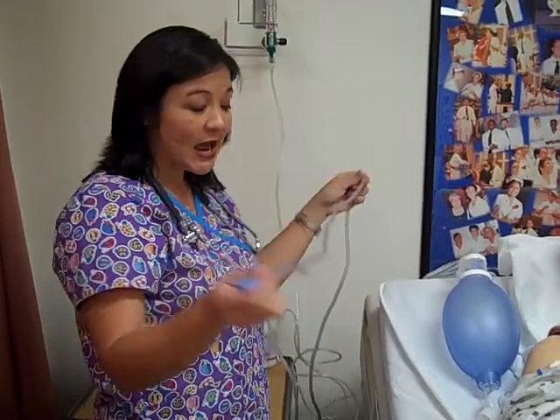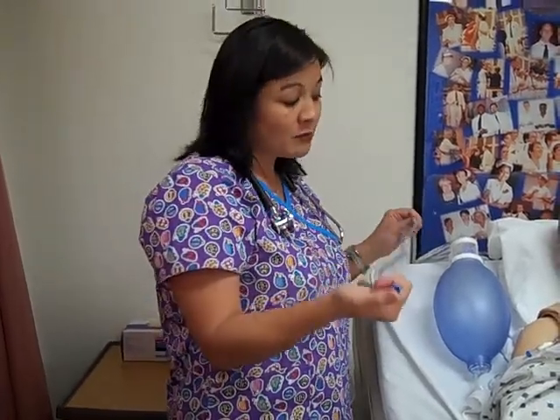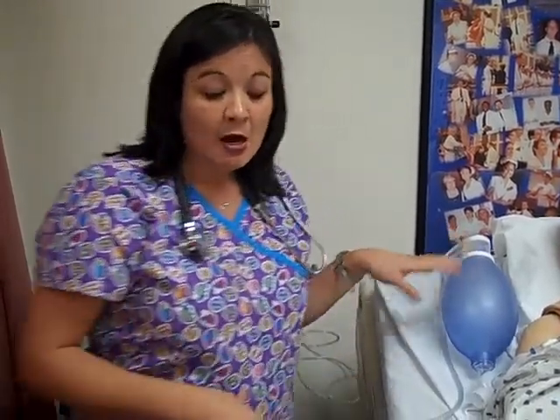You will need a suction catheter that is connected of course to your suction canister. You want to make sure that you set that on continuous, usually medium.